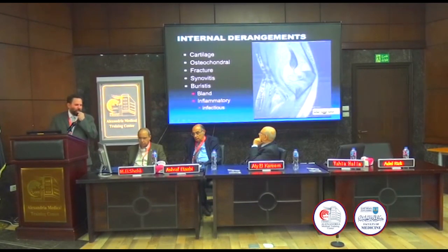I do my clinical work at a big hospital in Detroit, the biggest, called Henry Ford Hospital. And they have a template for dictation. Most of you probably have templates for dictation. And the template drives me crazy, because there's a line in the template that says, no joint fluid is there. Anyone has some joint fluid. They should say no abnormal joint fluid, no excessive joint fluid.